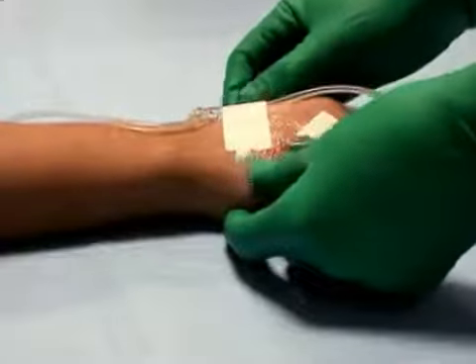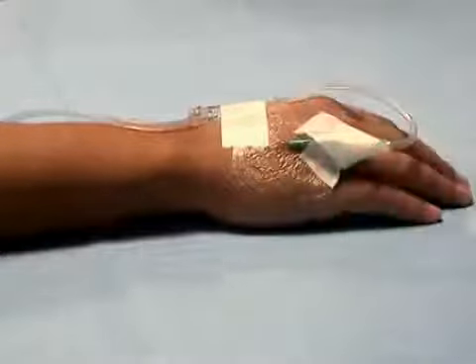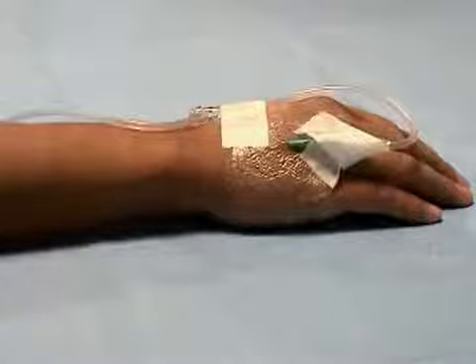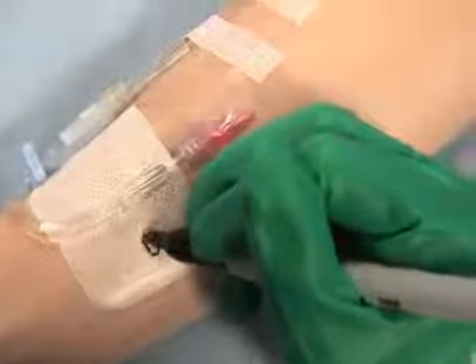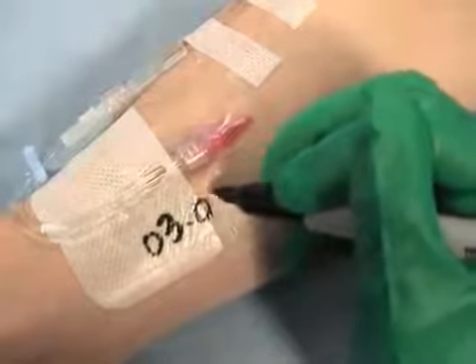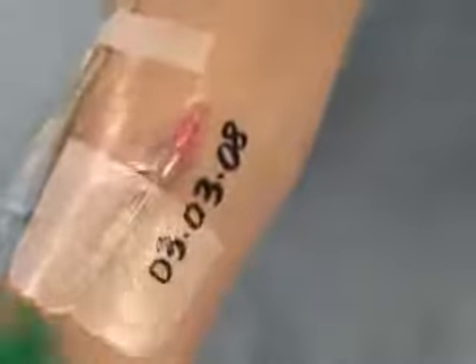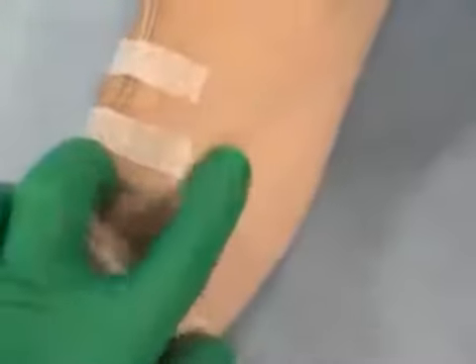Looping the tubing may prevent accidental displacement of the cannula, decrease cannula manipulation, and lower the risk of venous contamination or irritation. It is recommended that you write the date of insertion on the dressing to facilitate determining how long the cannula has been in place. To reduce the risk of infection, continue to review the indications for peripheral intravenous catheterization and remove the cannula as soon as possible.